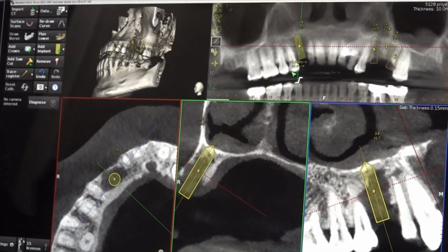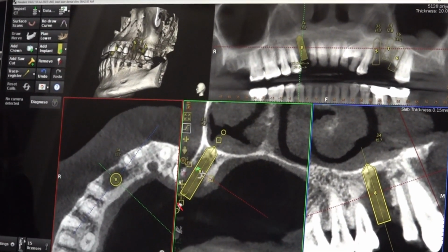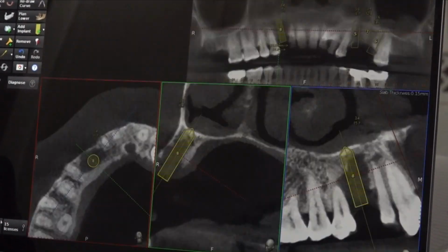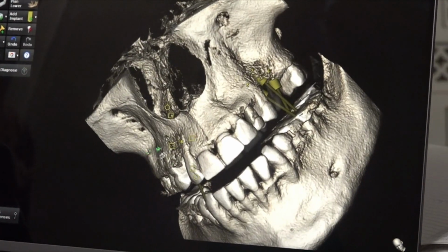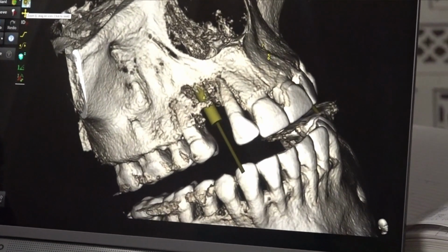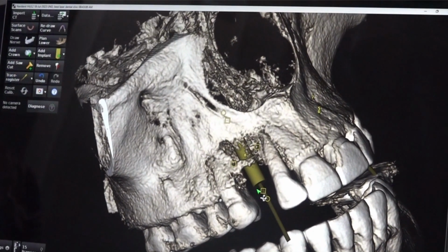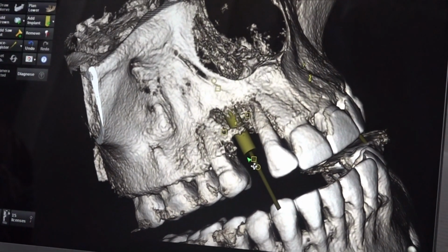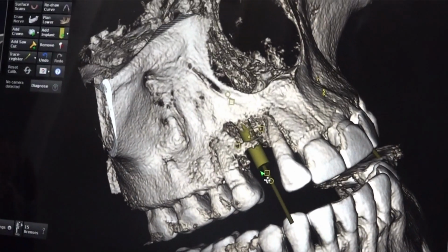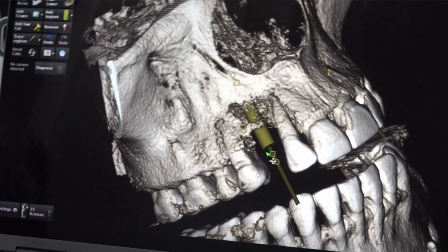If the patient is poking the implant with the tongue, then that also will get mobile. Or what we planned is to give the Maryland bridge now, right? Yes. That is a very good option in this scenario. The scenario is looking very ideal for a Maryland bridge. Definitely it will last for a long time if you design it properly and bond it properly, and if the material is a composite related material.